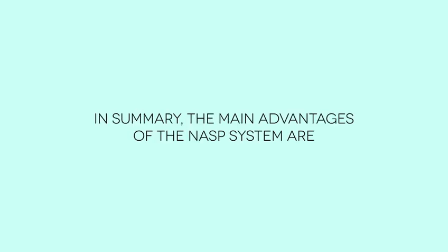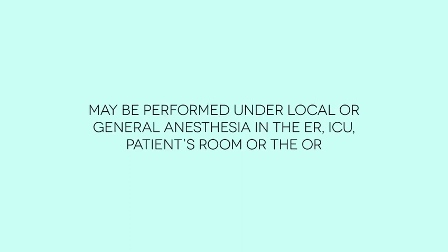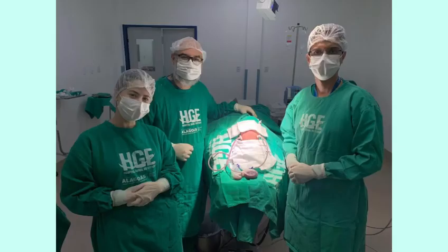In summary, the main advantages of the NASP system are minimally invasive, fast, portable, it does not touch the brain and may be performed under local or general anesthesia in the ER, ICU, patient's room, or the OR. It leaves no skull deformity and subdural recurrence rate is low compared to other treatment modalities.